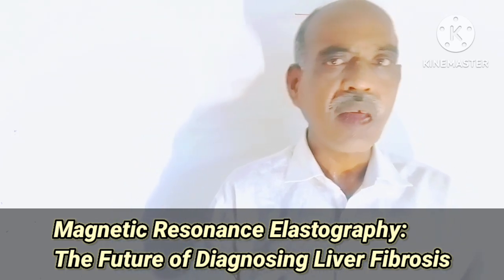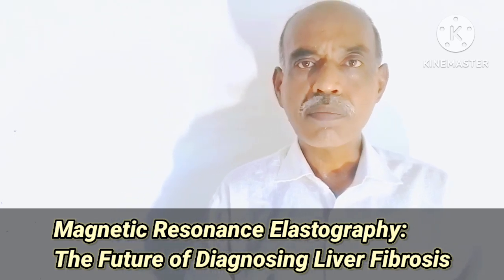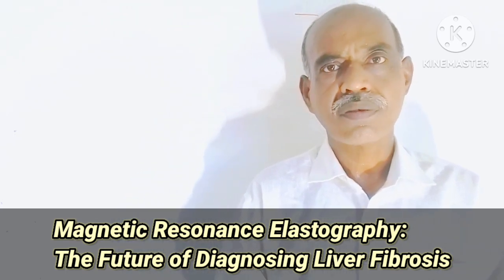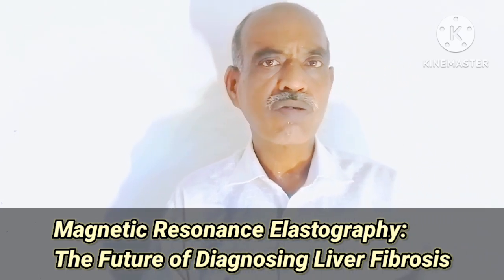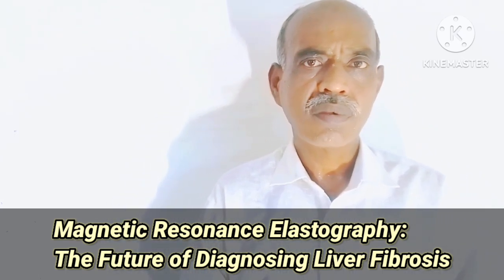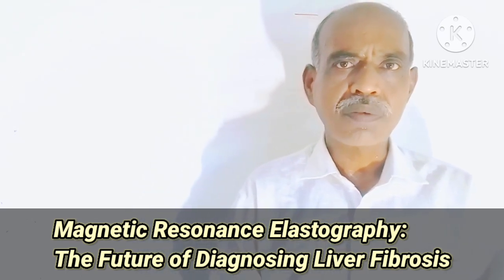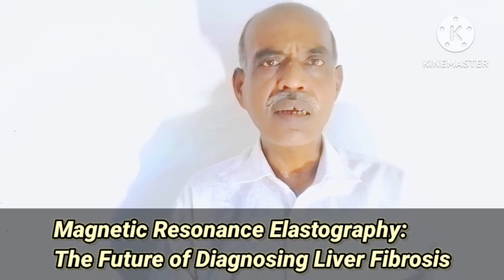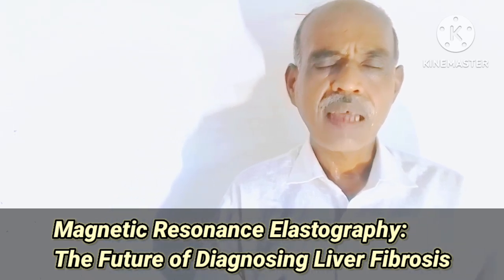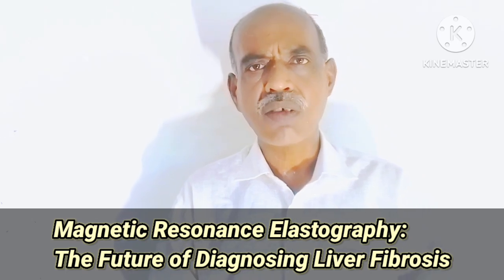And next, MRI is used. Now MRI detects the movement of the waves. Somewhere it is faster, somewhere it is slower. MRI detects the movement of those sound waves, and accordingly they create a high resolution image, and that image is here in this case known as elastogram.